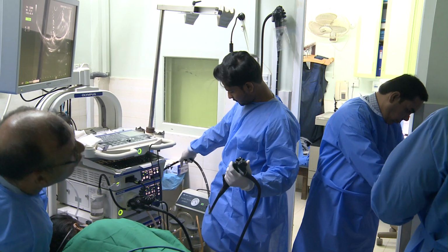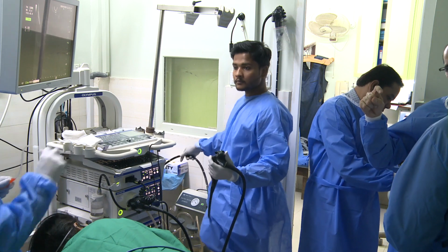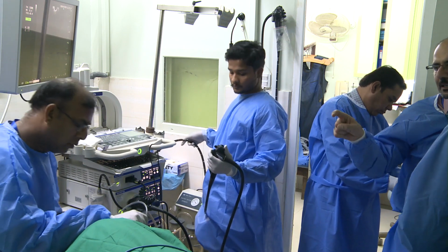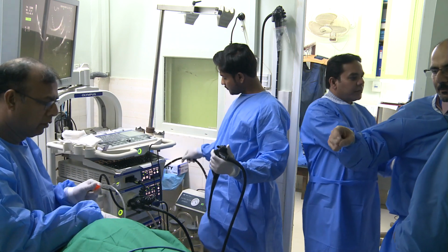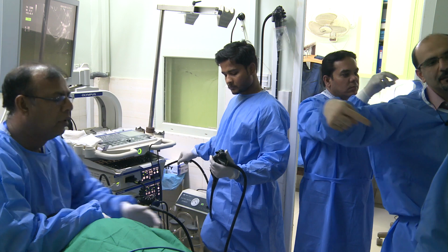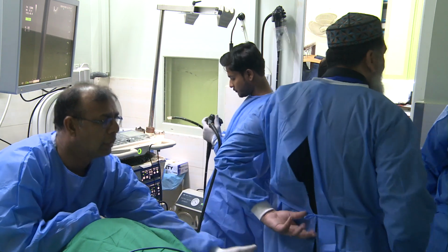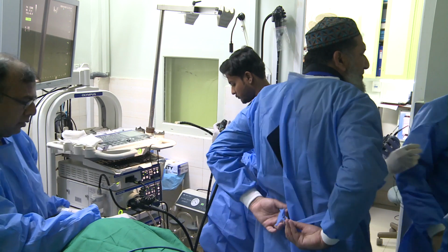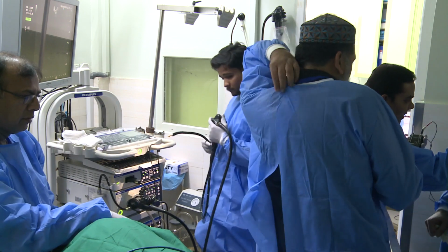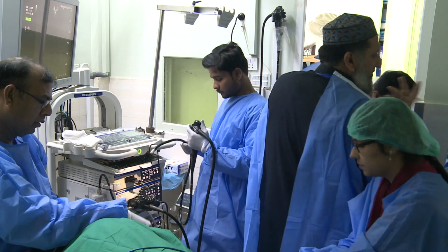A bit dip down. I would say about 90 degrees. You have to dip it a bit more to get over the tongue. And once it is over the tongue, you can extend it a bit because the esophagus is posterior, and then you can just advance. I do exactly the same with the ERCP. It's the same. You want to be comfortable with the feel of it.